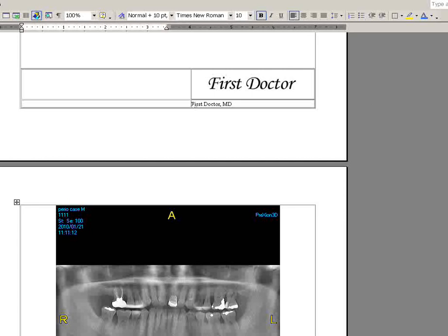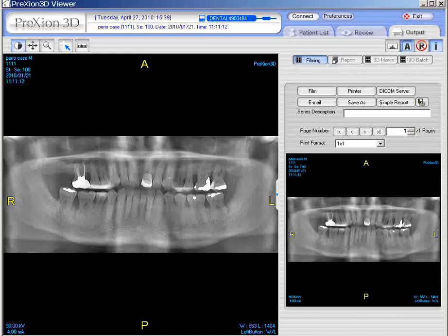Once it's captured, you go to the output panel and there are your images to select. You can also email them, by the way. If you have Outlook email, you can select Email and it'll automatically attach in that way. So that's how you capture images.